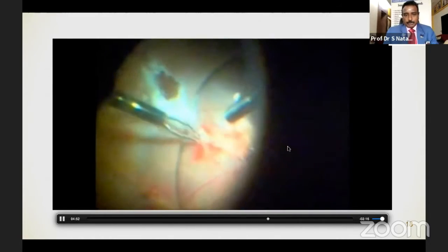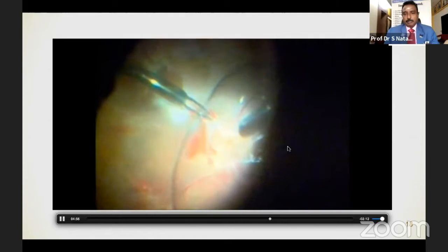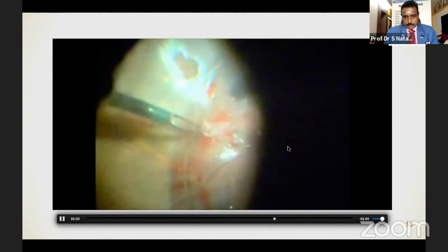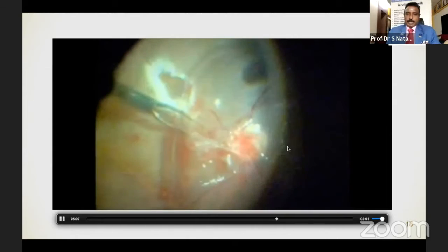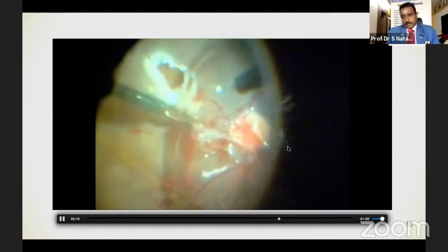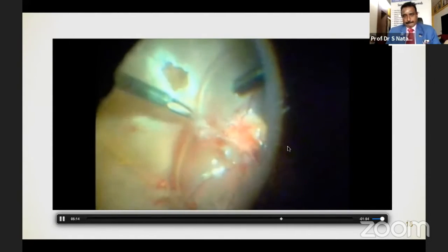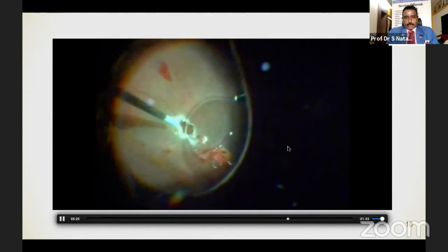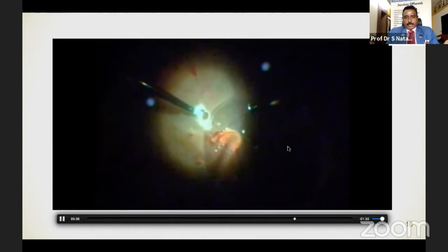So I'm using PFCL up to the fibrous tissue and the break, which is on the nasal side. I'm now using the PFCL as a third hand, and then using a vitreous forceps to grasp the membrane and sever the attachment. I'm judging how adherent it is by lifting the fibrous tissue. So now I was able to remove the fibrous tissue en masse, and you can see I'm having the PFCL, and then using the retinal brush, I'm going into the retinal break and doing an endodrainage and fluid air exchange, so that the entire retina is flat. You can see the retina between the optic disc and the break is also flat, indicating that there is no traction, and the PFCL makes sure the retina is flat.